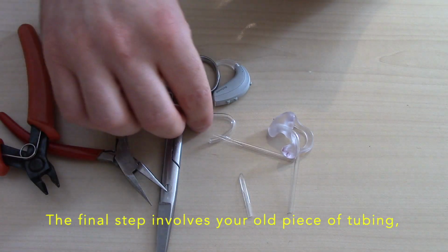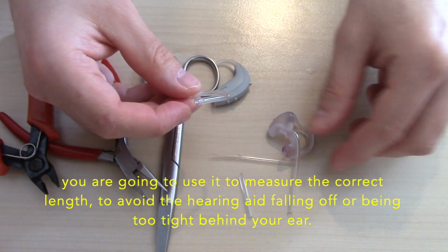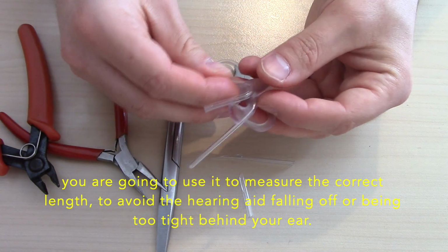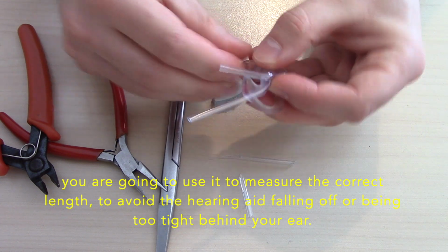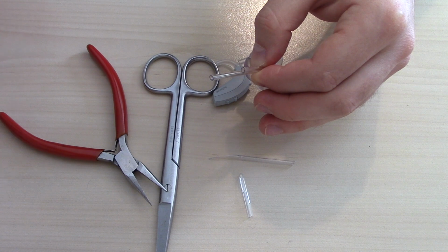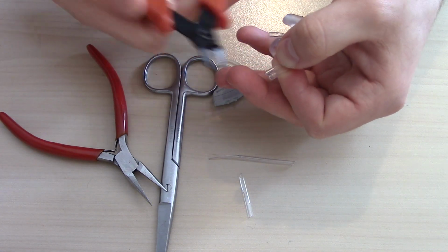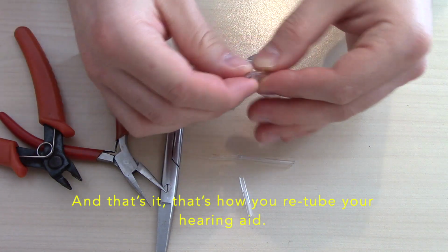The final step involves your old piece of tubing. You're going to use it to measure the correct length, to avoid the hearing aid falling off or being too tight behind your ear. Simply hold it up to the ear mould and cut to the old length. And that's it. That's how you retube your hearing aid.